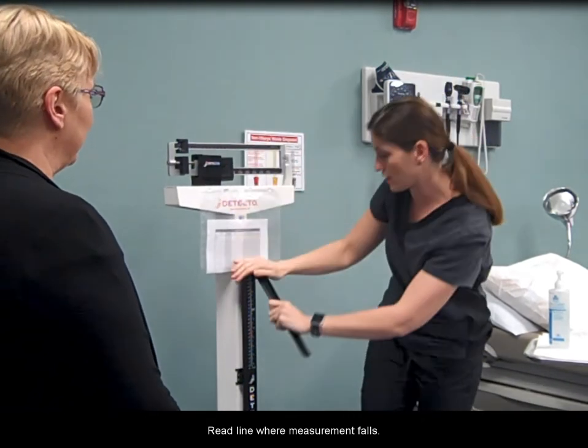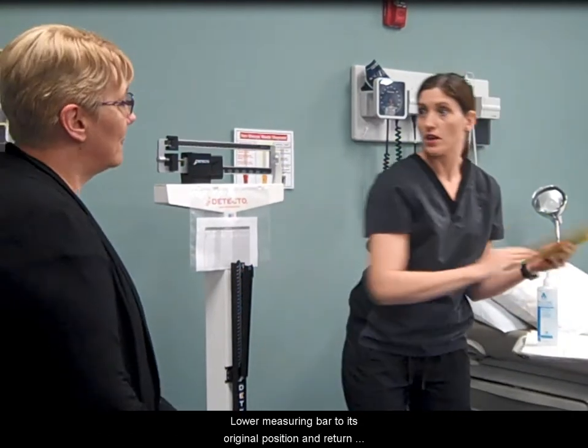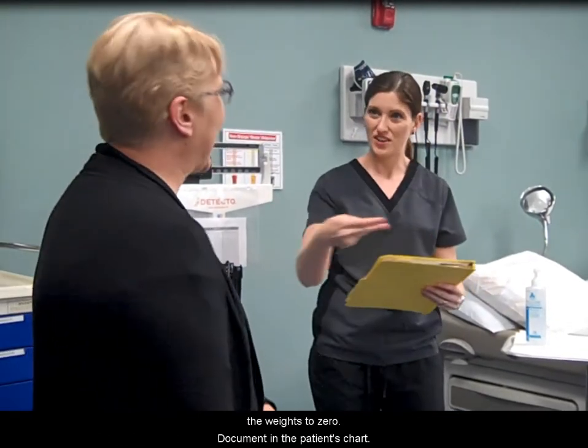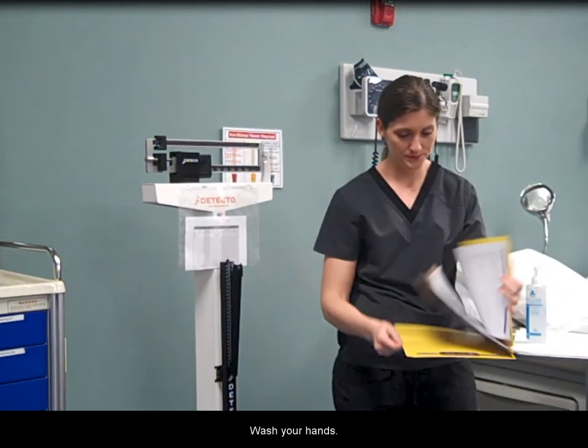Read the line where the measurement falls, round to the nearest quarter inch. Lower the measuring bar to its original position and return the weights to zero. Document in the patient's chart. Wash your hands.